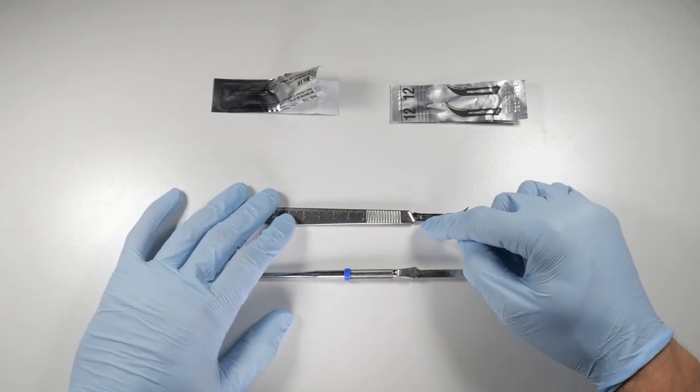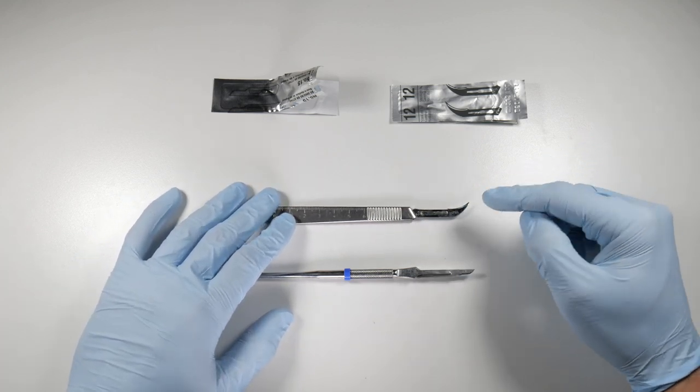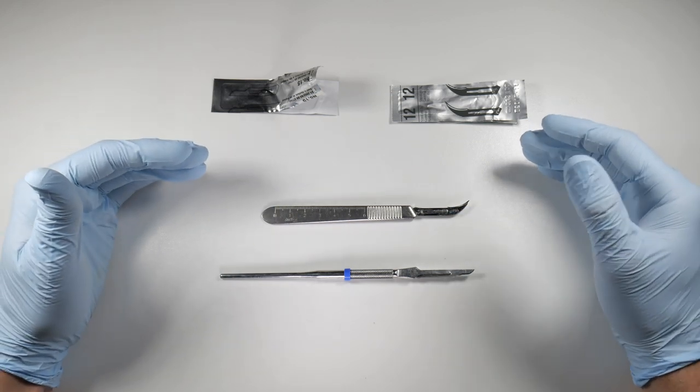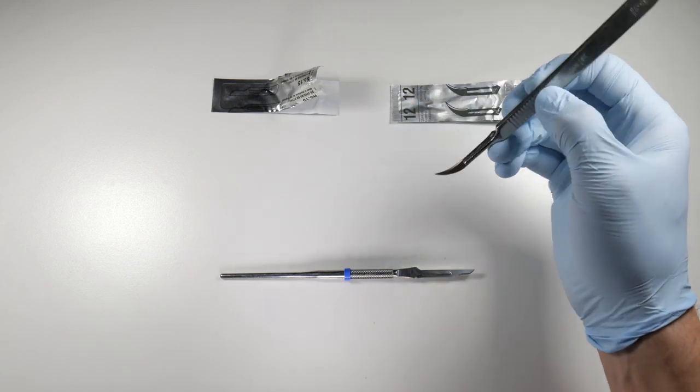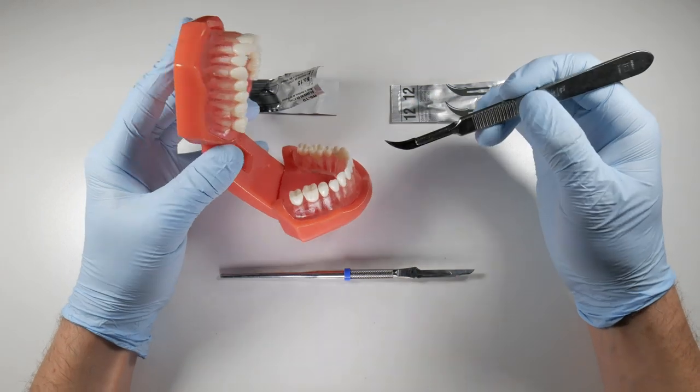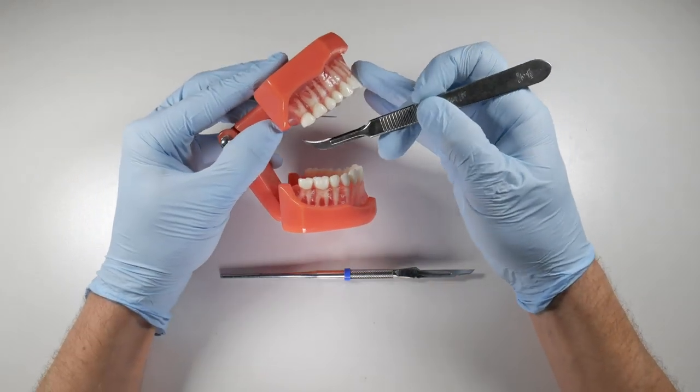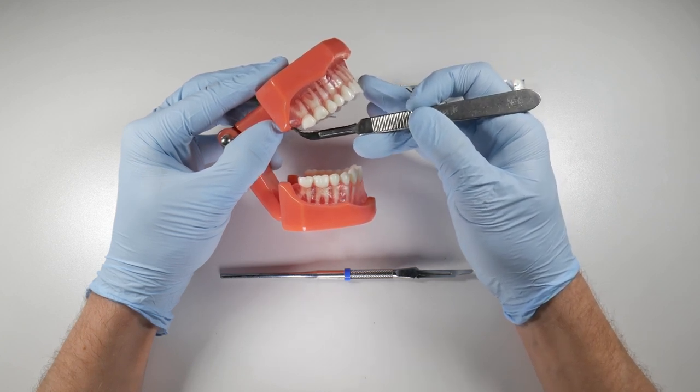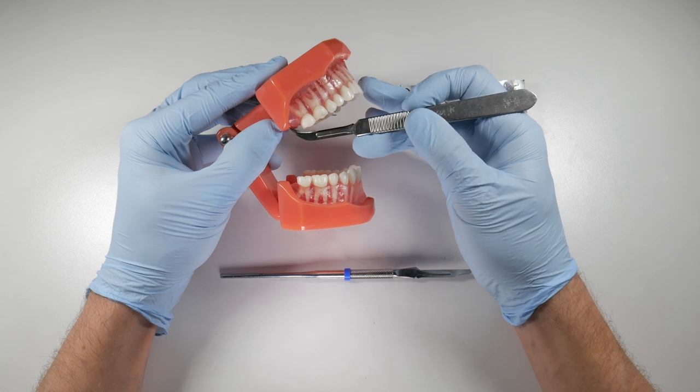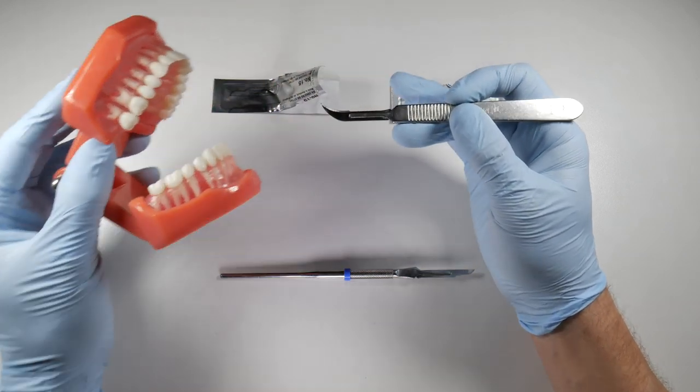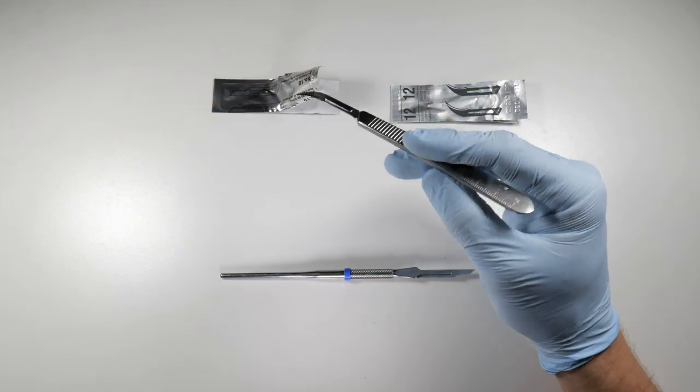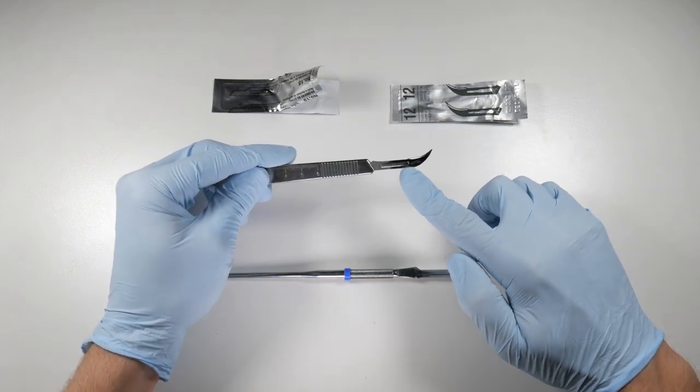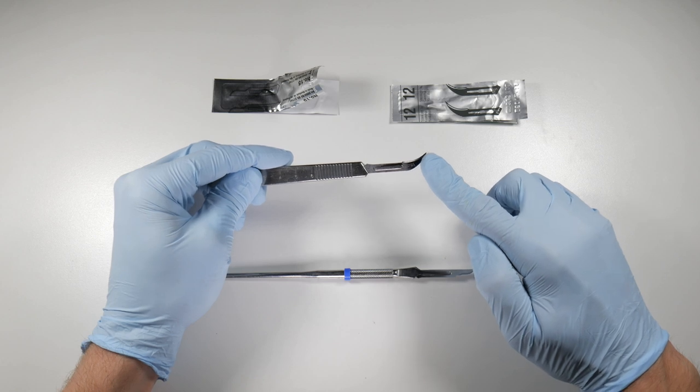Now if we move back to the blades here, the number 12 blade. The 12 is great for upper, say third molar incisions. You can reach in behind the tuberosity very easily because of this curve. We can get right up in behind the teeth to make that distal releasing incision up behind that upper third molar that's maybe still impacted under that tissue. Now you have to be very aware with the 12 because it also comes as a 12B blade.